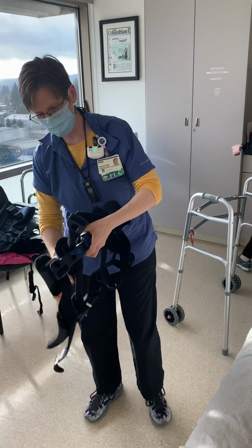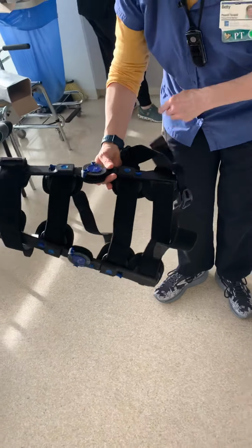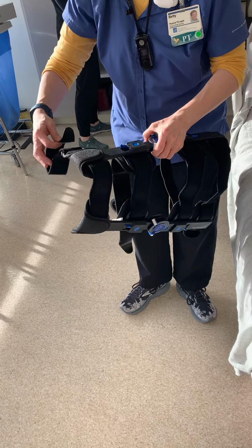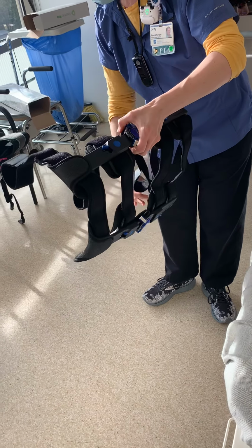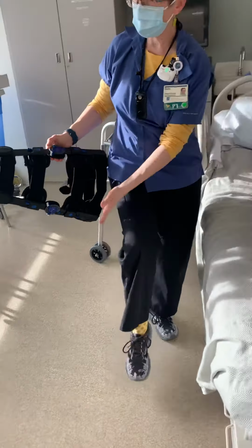So these braces here are our hinged knee braces. I believe they're called the Warrior brace. A lot of the time we end up referring to all of these as Bledsoes, but that's not what this brand is. These are really nice if the surgeons want them to be able to bend to a certain extent, but they don't want them to be unsupported on the sides.